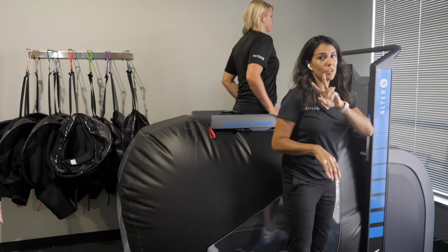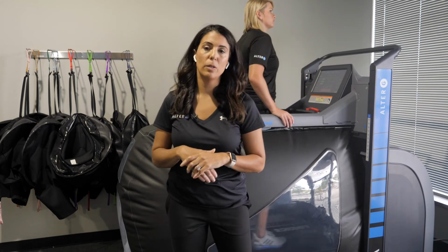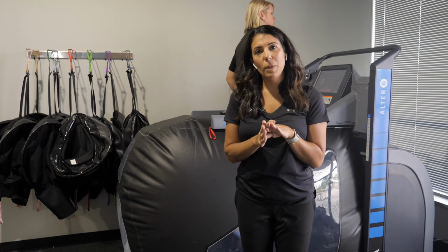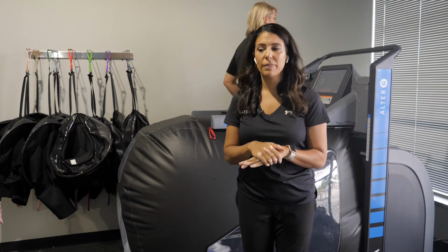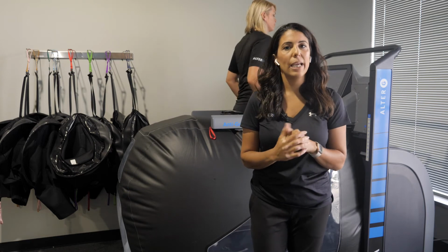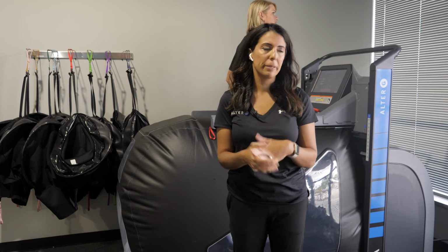There are two more features that we can activate when we're simply walking and looking at the parameters. One of them is crossover gait. So if you do have a patient with a really narrow base of support or scissoring, if they truly are scissoring and have a scissoring gait, you can click on crossover gait, and it's just going to have the load cells be a little bit more accurate in the data that they pick up.